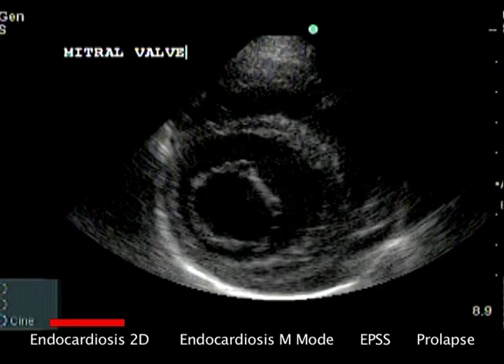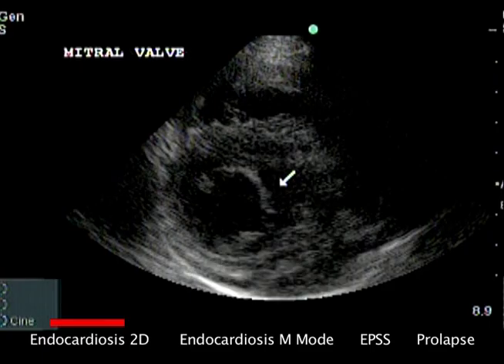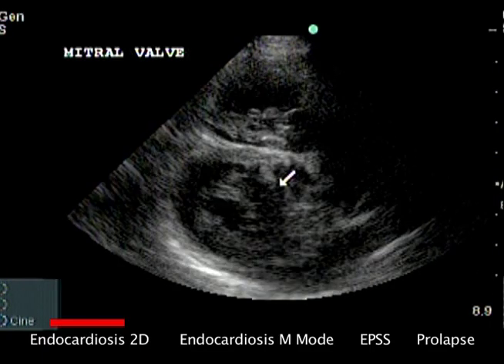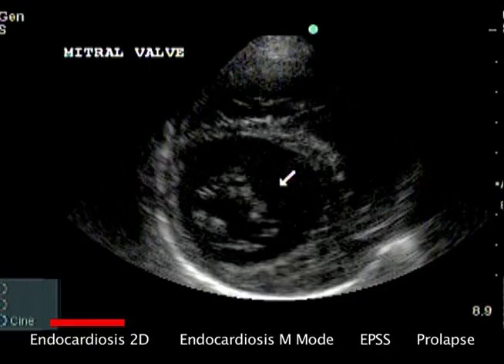Degeneration begins with subendothelial deposits of mucopolysaccharide and areas of fibrosis producing a ballooning or thickening of the valve leaflet or chordae tendineae. A lack of visible valvular lesions on ultrasound does not rule out the presence of endocardiosis.